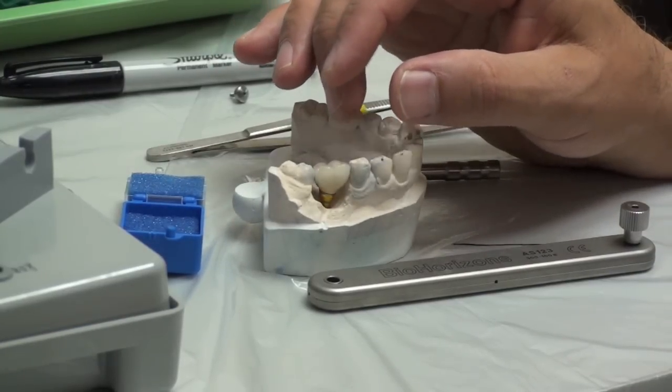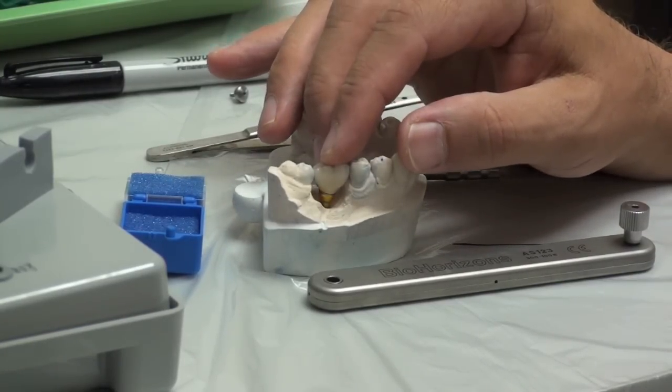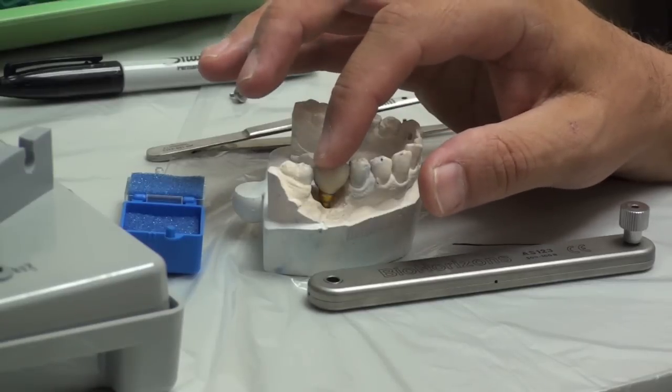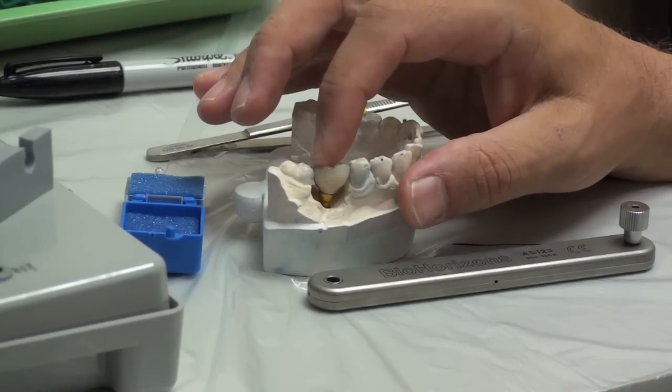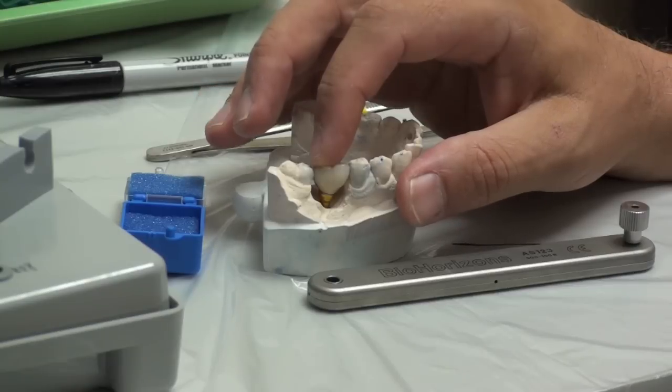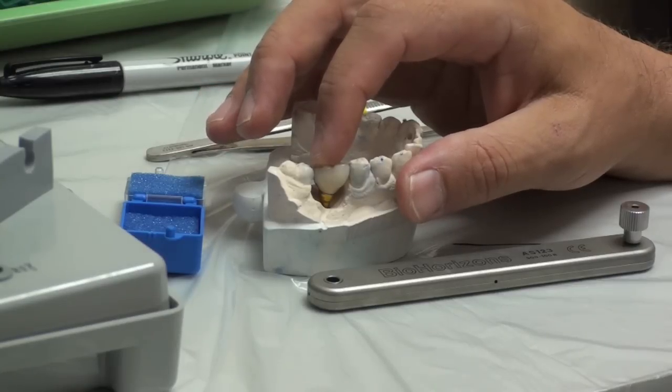The patients will tell you too - that hurts when you push down there. If you see blanching and it's hurting and bouncing, you've got tissue contact. If it looks like it's really severe, get the doctor. Maybe we have to numb the patient up and do some tissue contouring with a laser.